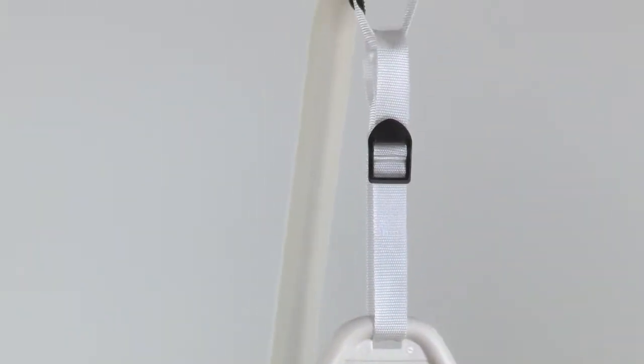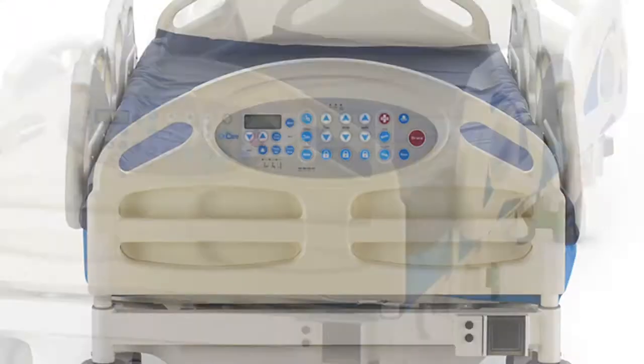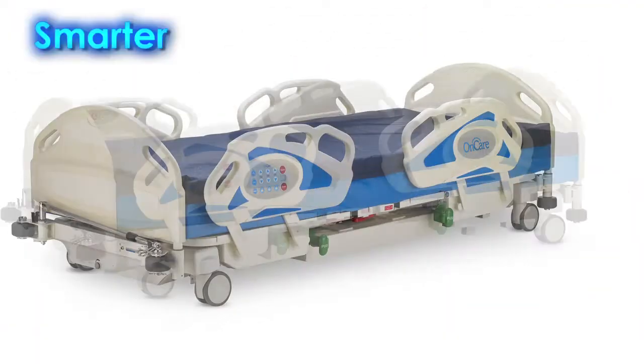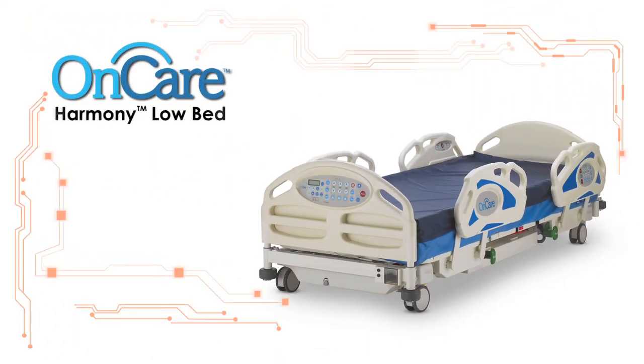Optional features include a trapeze and patient control hand pendant. The new OnCare Harmony bed — the smarter, safer, better performing choice. Setting the standard for acute care.